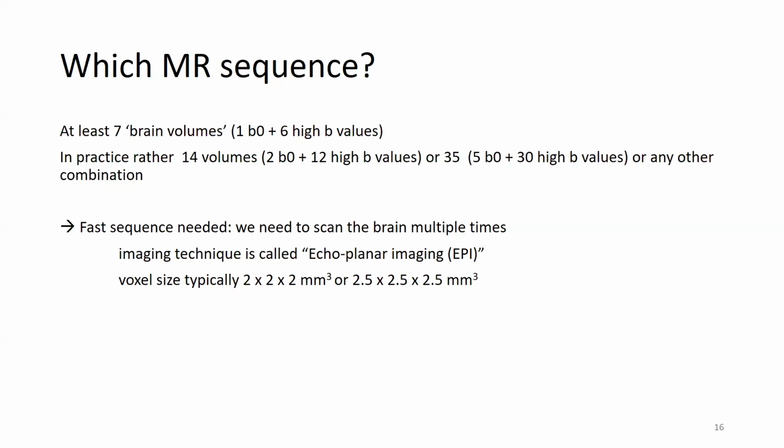No idea? Typically 1 millimeter when in what I call a 3D sequence, a three-dimensional sequence where all my voxels are the same size, so in all directions I typically have 1 by 1 by 1 millimeter. That's nice. Then I have good spatial resolution. But it takes about 4 or 5 minutes for this scan.